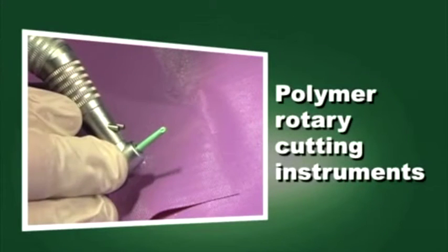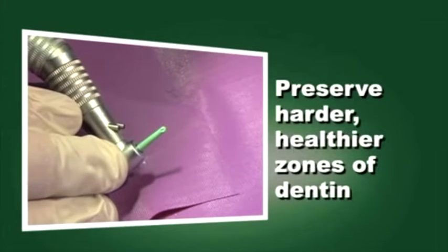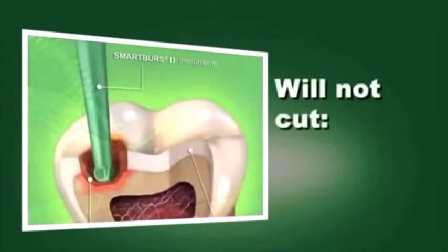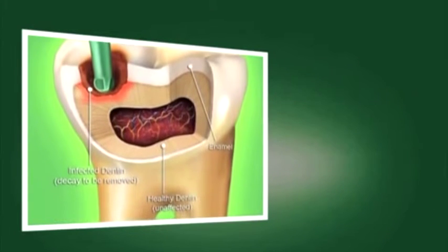Smart Burst 2 are the only polymer rotary cutting instruments designed to remove soft infected dentin and preserve the harder, healthier zones of dentin. They will not cut enamel, healthy dentin, composite, or amalgam during caries removal.